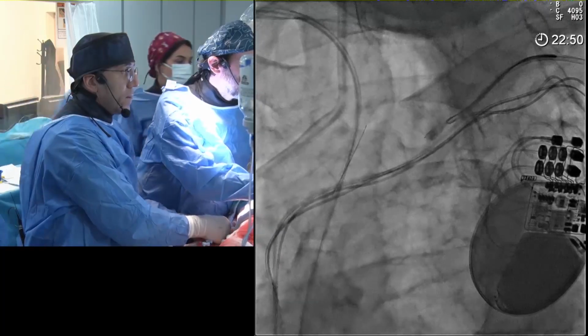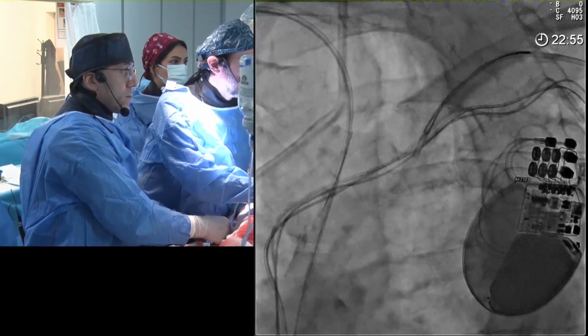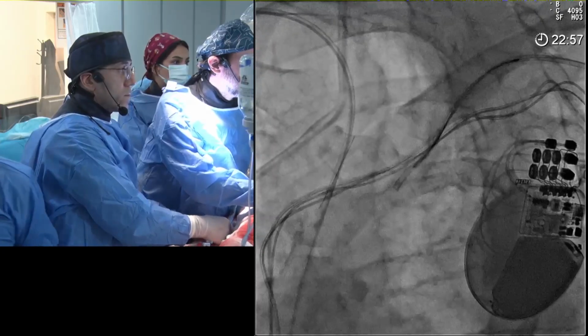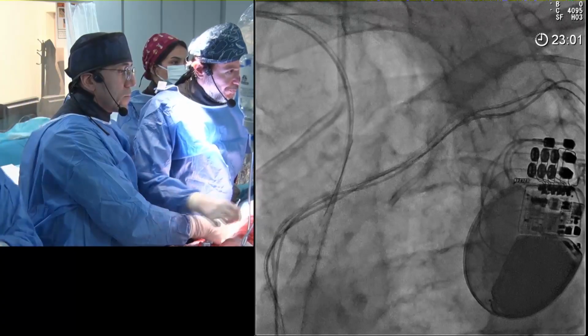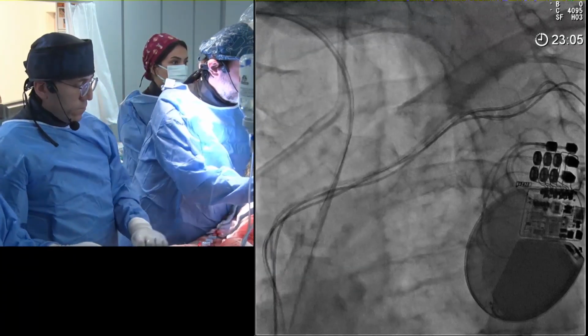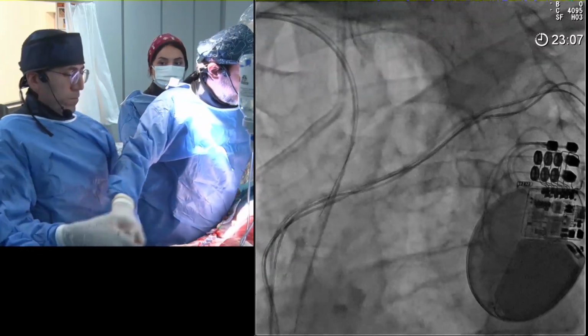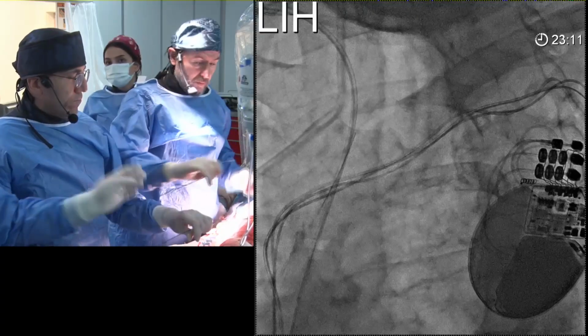And yes, sure, you can snare this, but it's quite possible that you may be traveling in the aortic wall. And I think it's not unreasonable to actually use your retrograde gear as a marker, take a JR4 guide and do an antegrade puncture. And now that you've resolved some ambiguity with the RCA ostium, to actually pursue an antegrade approach. That's an option. That's a reasonable option as well.